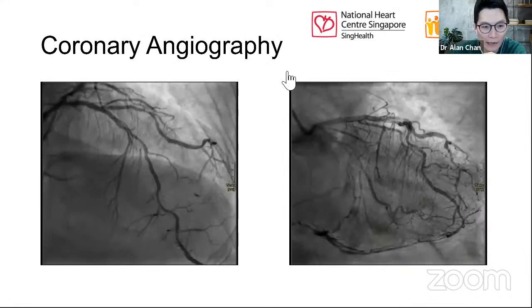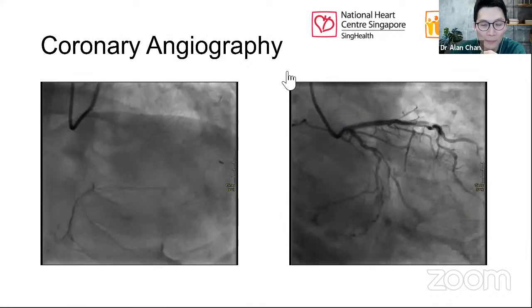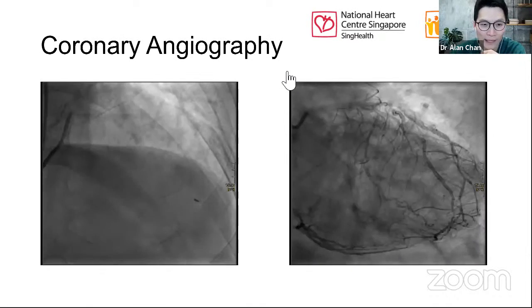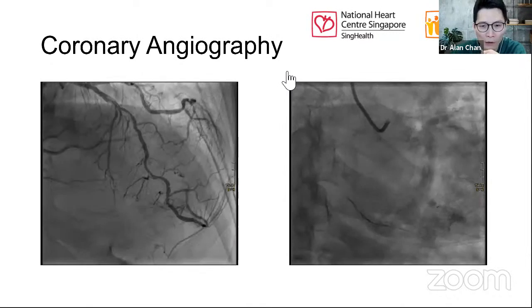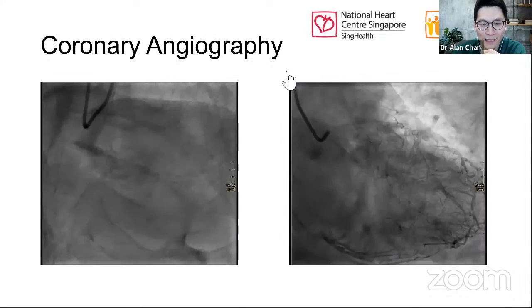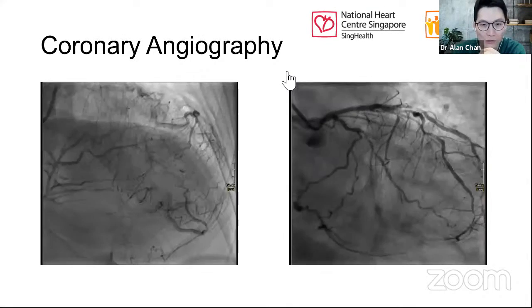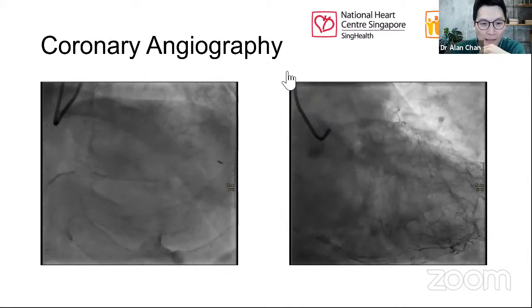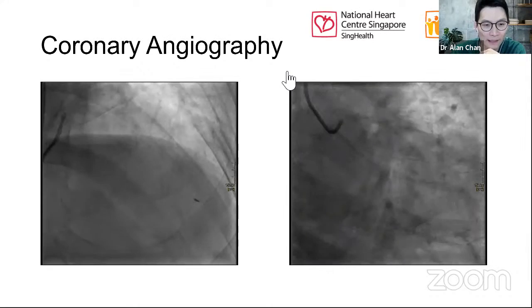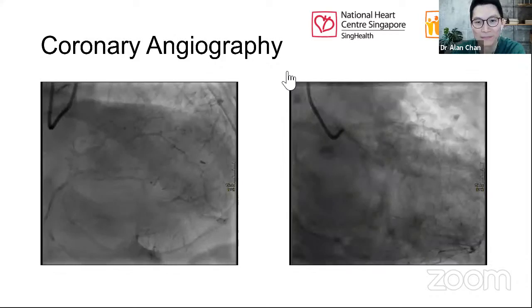Sometimes in our scenario, we may, for example, take a guide extension to deep seat into the proximal LAD and get a better shot. Of course, it takes extra cost and risk. Because you also have a huge left system territory, in case you just take the guiding shot, most of the contrast will distribute to, for example, the diagonal, the circumflex, and the fairly distal LAD. But I'm pretty sure the latest OCT catheters are able to cross these lesions, right? Should not be a big problem.